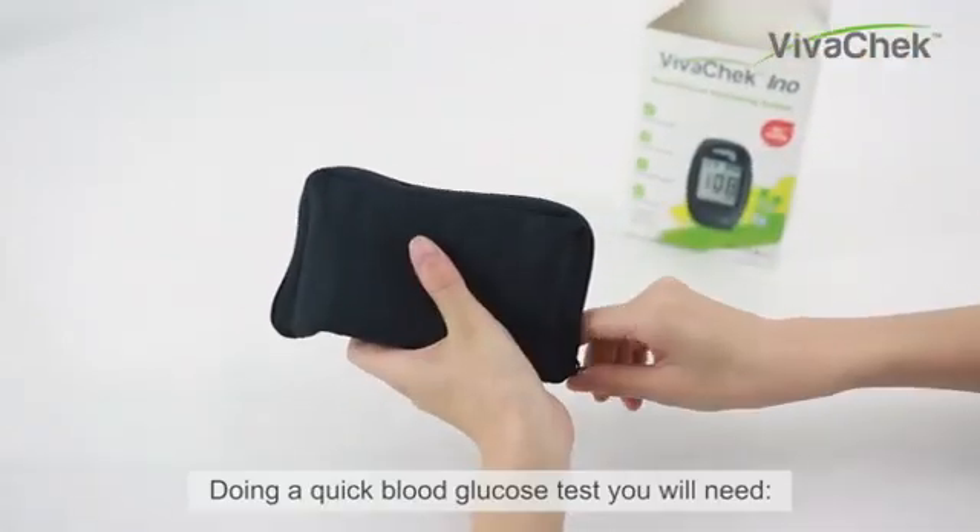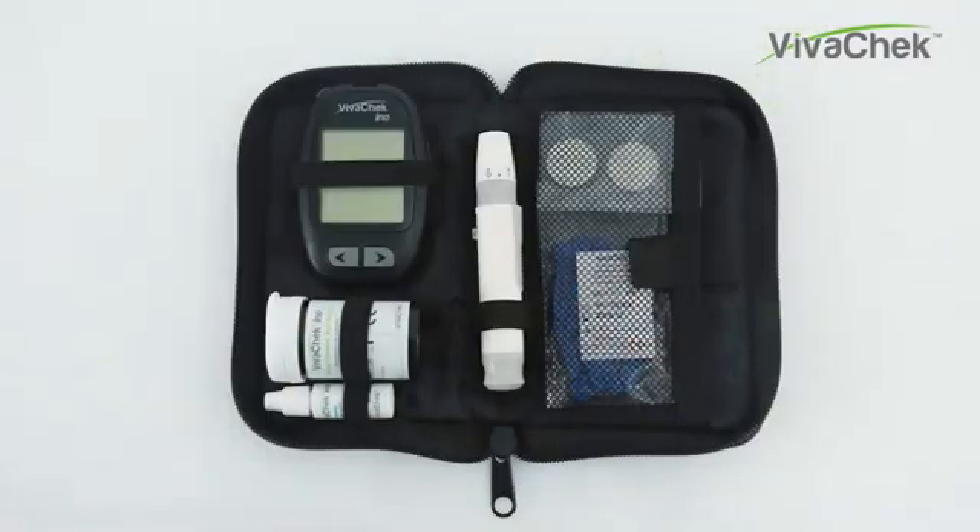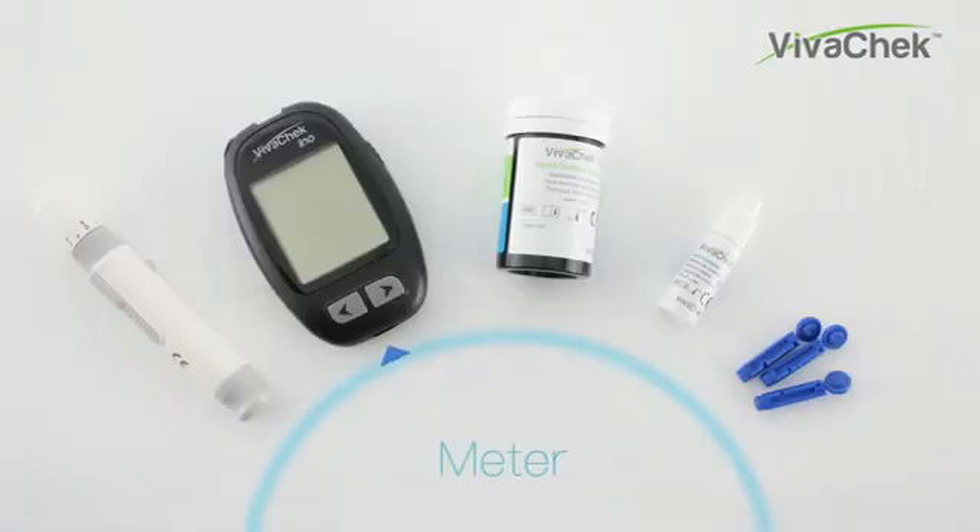For doing a quick blood glucose test, you will need a lancing device, VivoCheck InnoMeter, VivoCheck InnoTest Strips, control solution, and lancets.